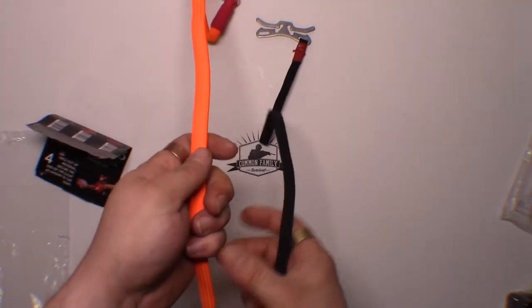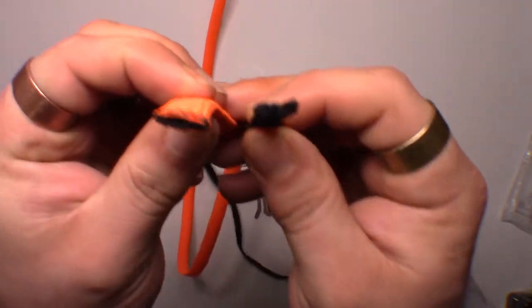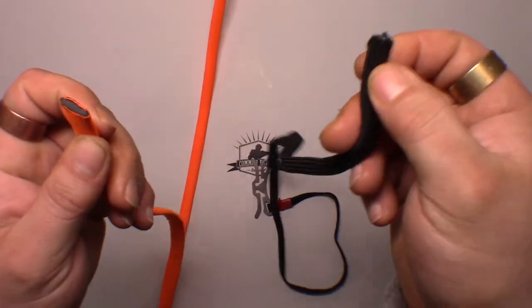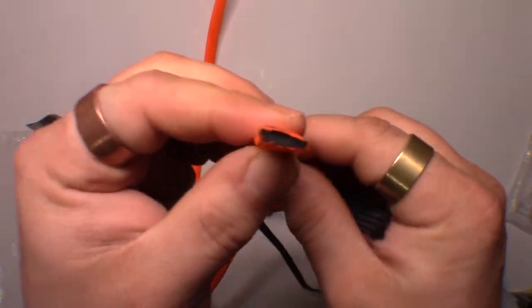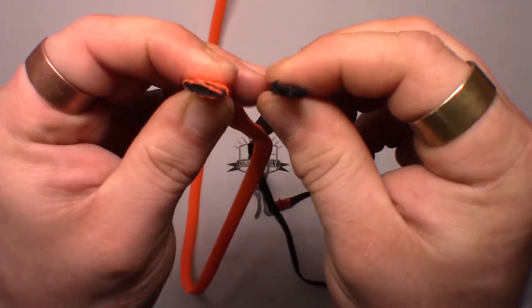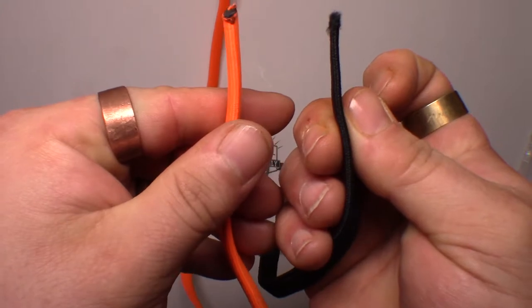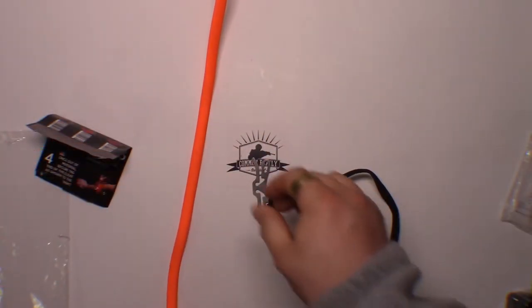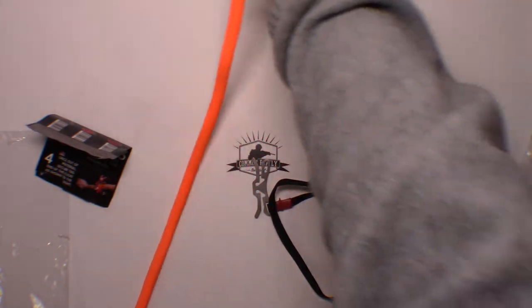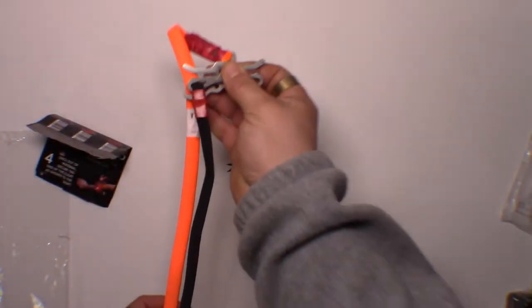Next up, the material. You can tell a major difference right out of the chute. The fake is like some kind of elastic - something you'd find sewn on underwear - where the real one you can actually see there's like a rubber core in there, and this stuff is thick compared to the fake. Lengthwise, we're talking probably a good almost three feet on the real RATS tourniquet, and on the fake one you're lucky if it's two feet long.